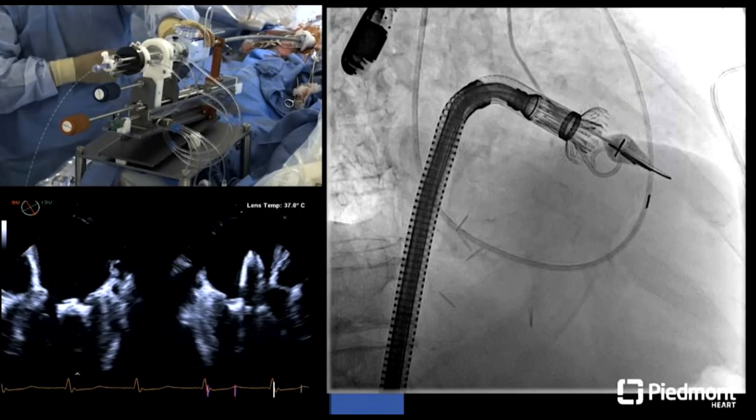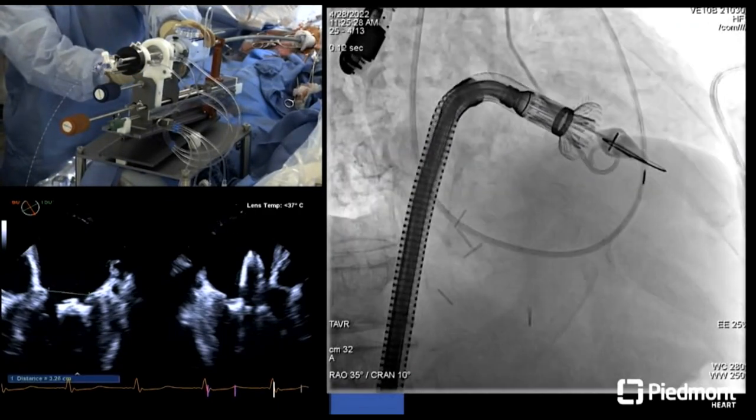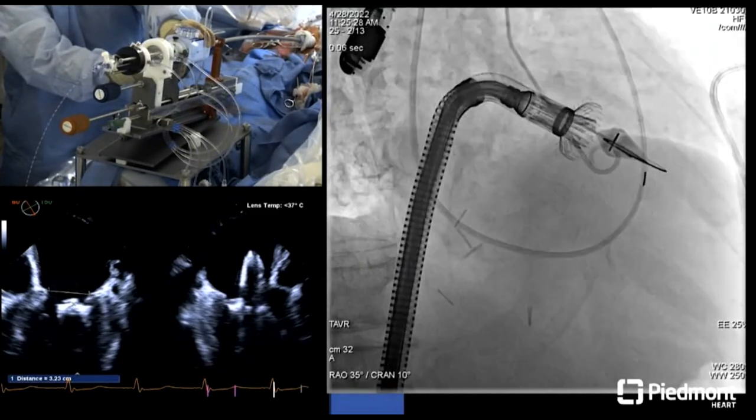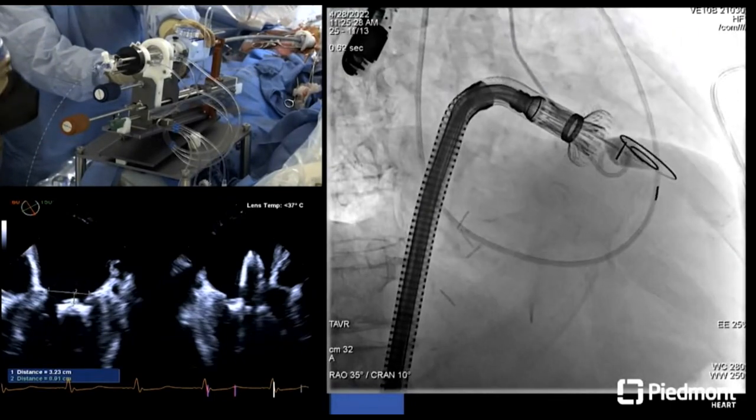Once you open the ventricular edges, the tines are out, you measure the depth from the annulus, which you can notice on the TEE you're measuring. These are pre-specified numbers that the company gives you. You want to be high.